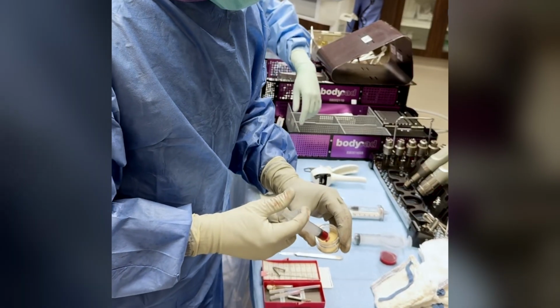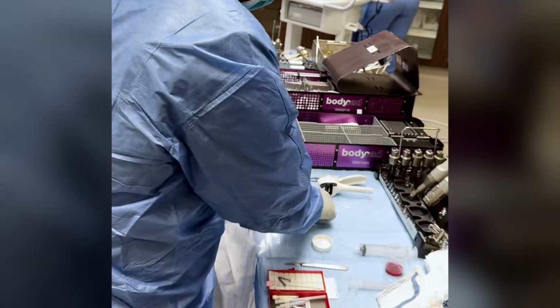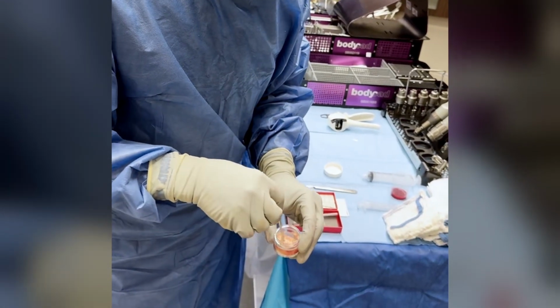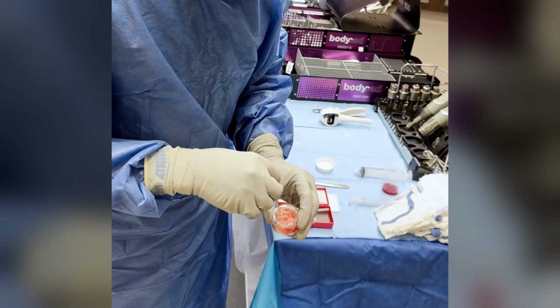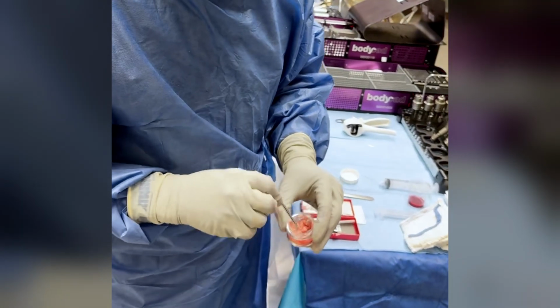So what we do here is mix the patient's stem cells. You guys have a sprayer there for me? We're gonna mix the patient's own stem cells, bone marrow aspirate concentrate here, with the demineralized bone matrix. And this creates this little putty that you see here.